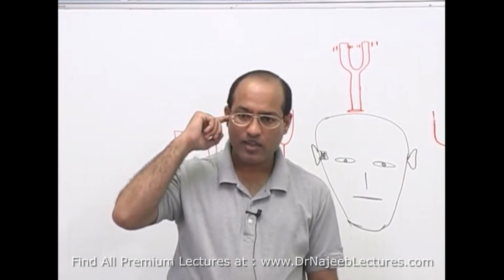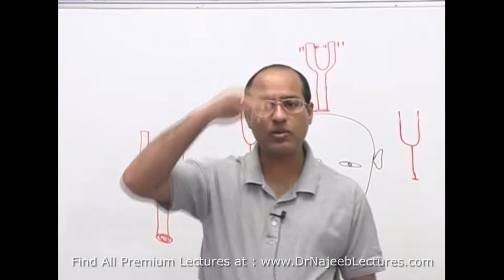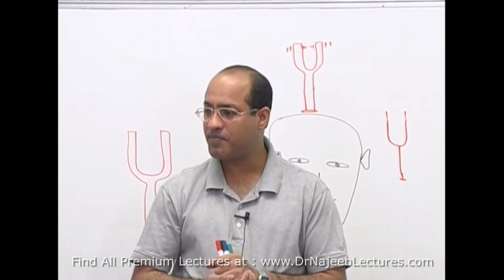But if there is conductive deafness on one side, let's suppose there is conductive deafness here, right, and there is no conductive deafness on this side, now one ear will hear more. Which side will hear more? The side with conductive deafness. Why?